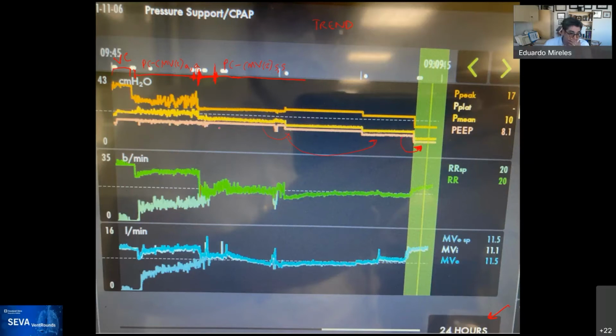But the point being is that this trending feature helped us see in a direct way the amount of missed interactions that were happening with the patient, and know in what mode the patient was and how the interactions improved.